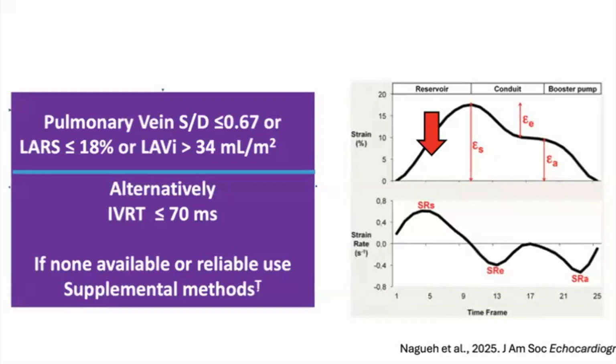You know, as you'll recall, normal values across both sexes and most age groups is kind of roughly 30 to 40%. You know, and some studies have proposed different cutoffs, but at the end of the day, we're playing this game where we're trying to trade off some sensitivity for a false positive rate, and a cutoff of less than or equal to 18% is sort of the one that's been agreed upon as the best balance of the two.